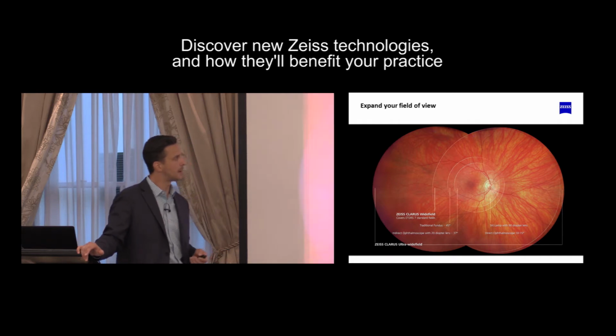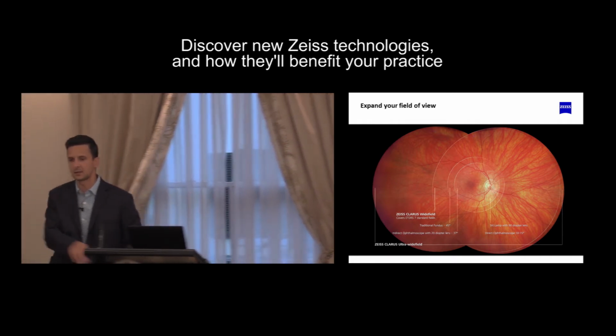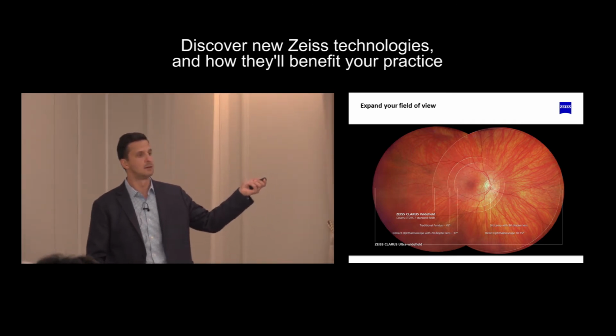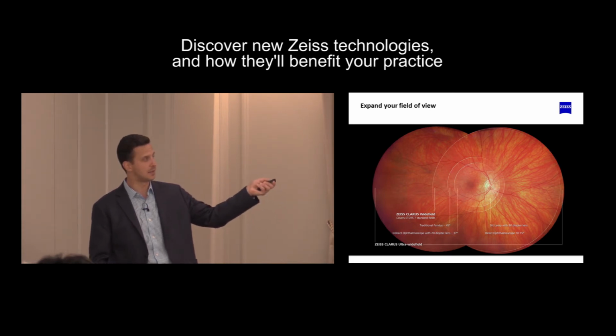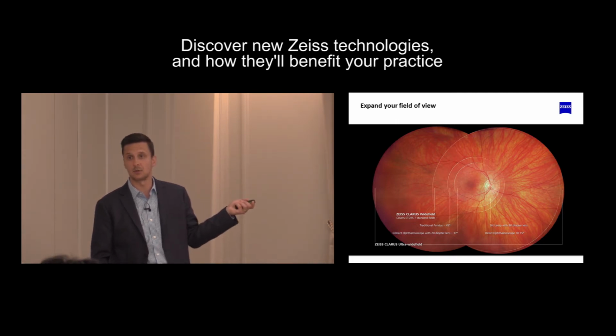And I'll show you a little bit about how that gets taken, but you can see, just as I scroll back and forth between these two pieces, this is the same image as what's right here. And you don't lose anything in resolution when it comes to the image that's on the screen here. And I could blow this up one more time, and I have a couple examples of that we'll look at next.